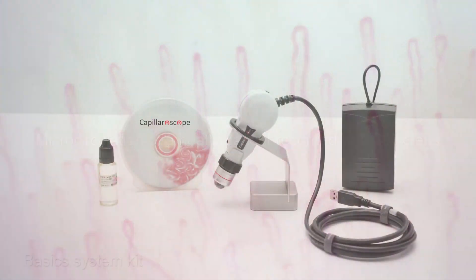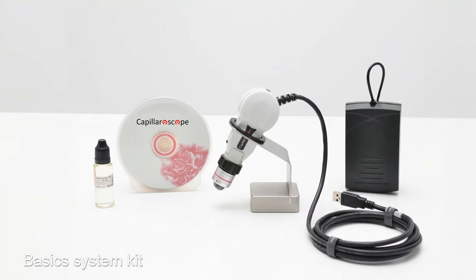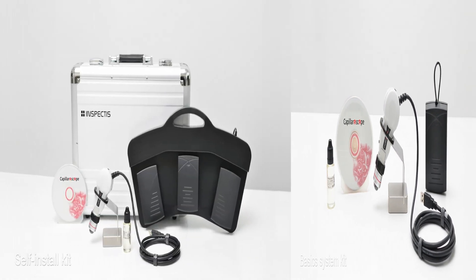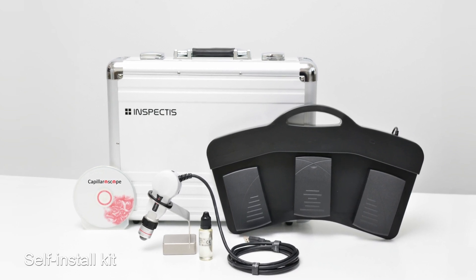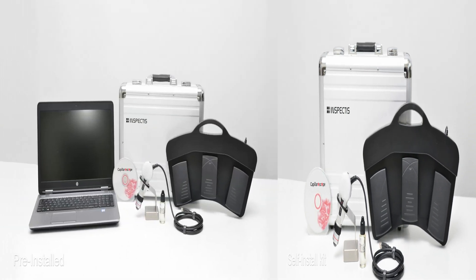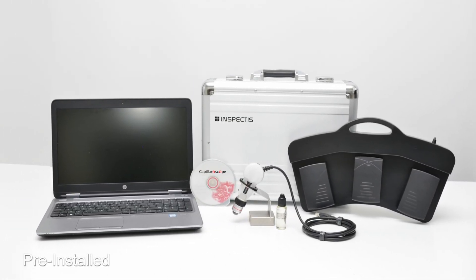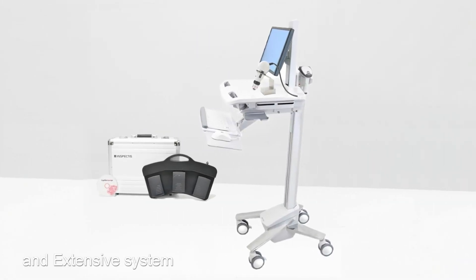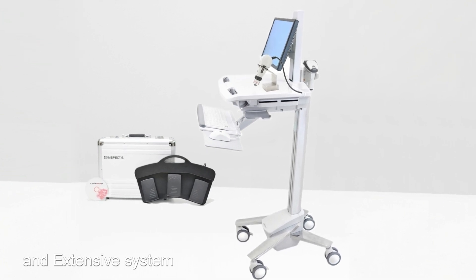The Inspectis Capillaroscope is available in a basics configuration — self-install with Capillaroscopy Pro software, 200x lens and 3-pedal foot switch — as a pre-installed turnkey system with computer and software, and as an extensive system with all you need with a medical cart.